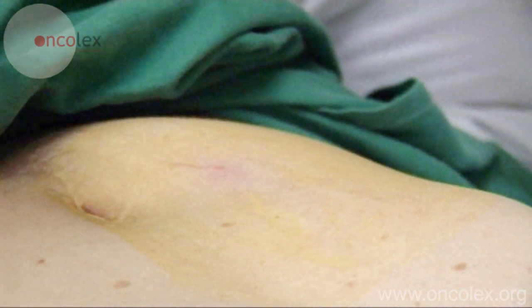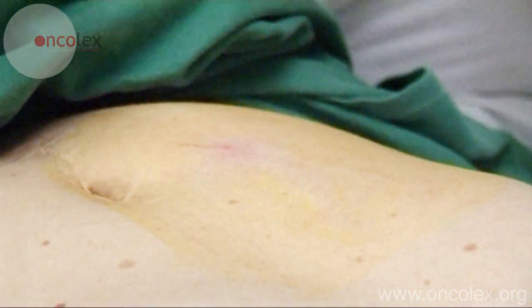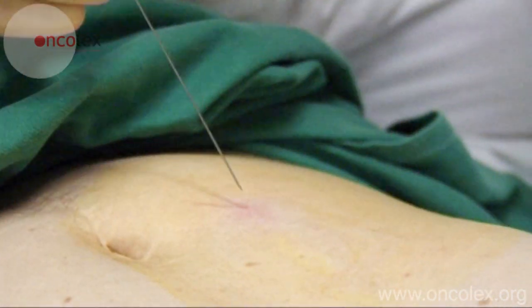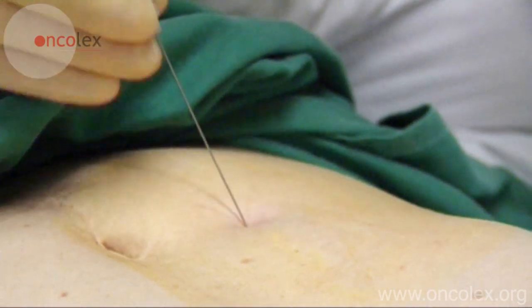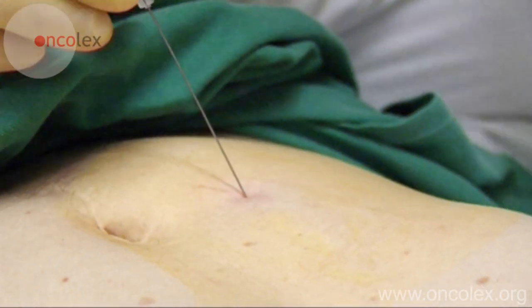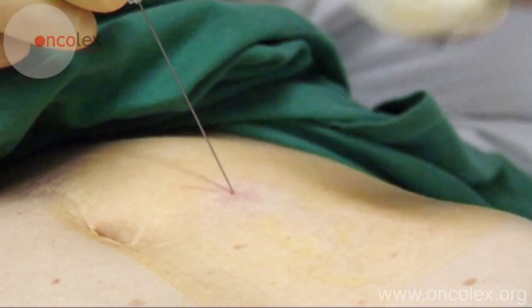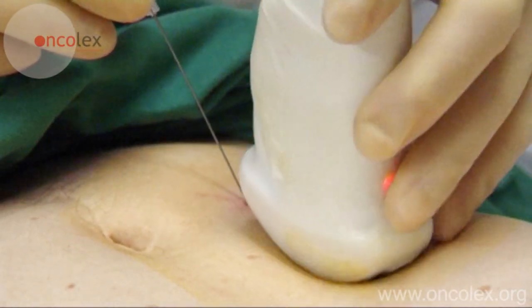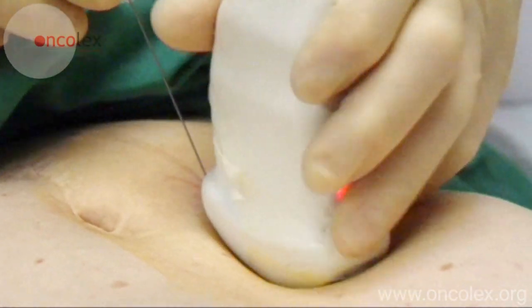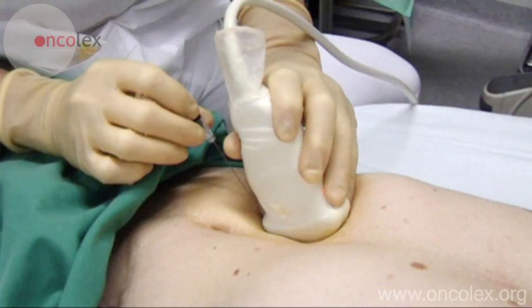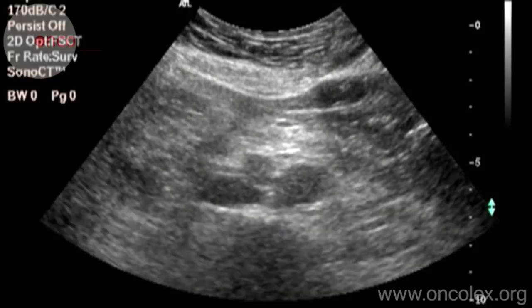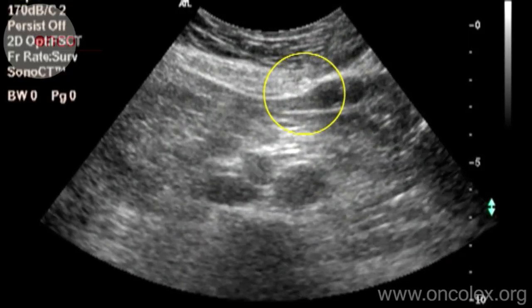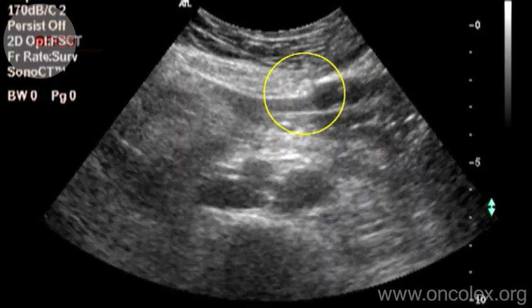This is a video of a fine needle biopsy from a lesion located deep in the abdominal cavity. The needle is pricked quickly through the skin. Guided by ultrasound, the needle is moved through the peritoneum and into the lesion.